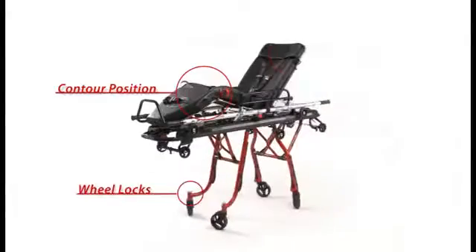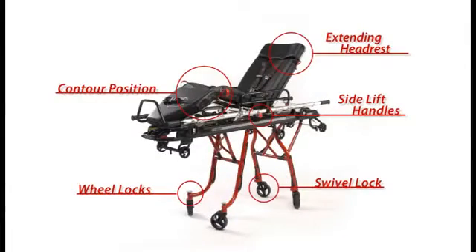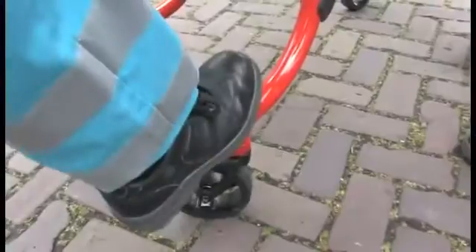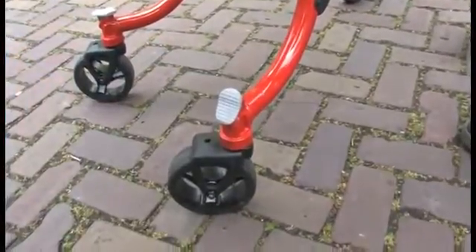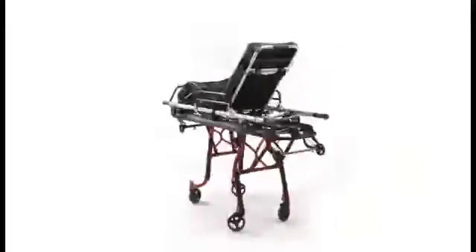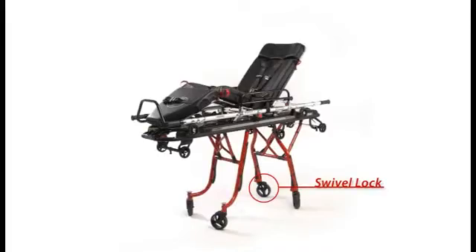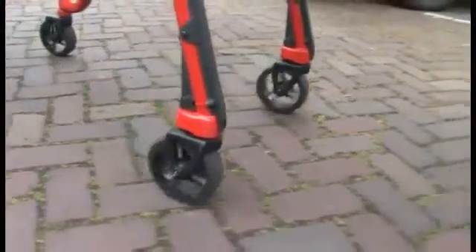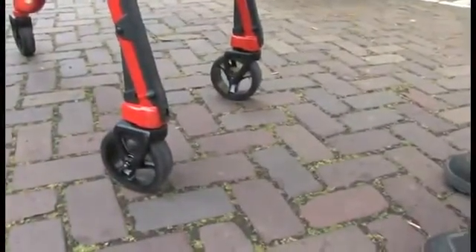Other operations. The Ferno Mondial includes a wide range of innovative safety and handling features. To lock the wheels, press down on the wheel lock lever with your foot. Kick the lever in the opposite direction to unlock the wheels. For added maneuverability, pull the blue front wheel swivel lock release lever to allow the front wheels to swivel in any direction. When the handle is released and the cot rolls forward, the wheels will lock back into place.